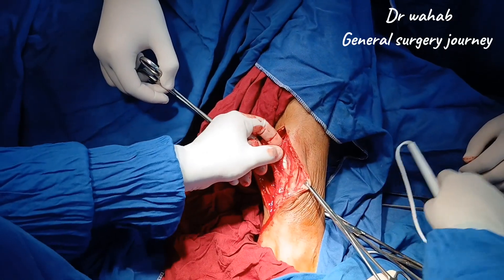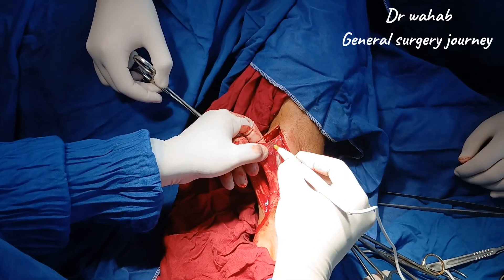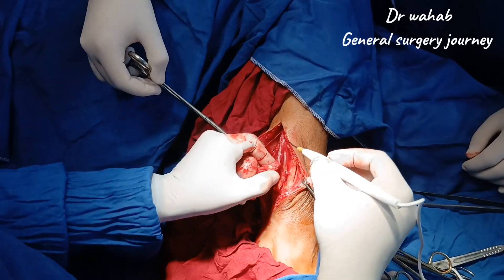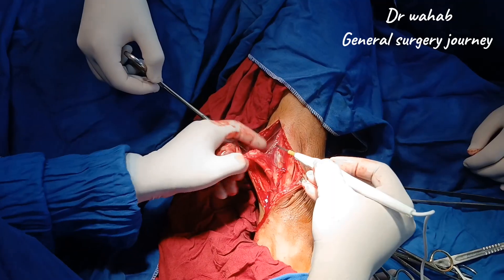Once the lesion is completely freed from its bed, we carefully excise it in one piece using monopolar cautery. After removal, we inspect the cavity for any residual tissues and ensure complete clearance.